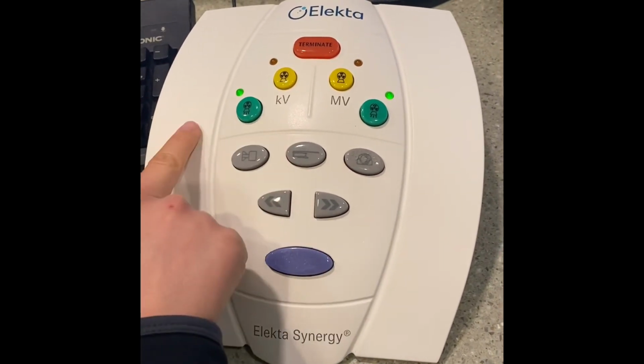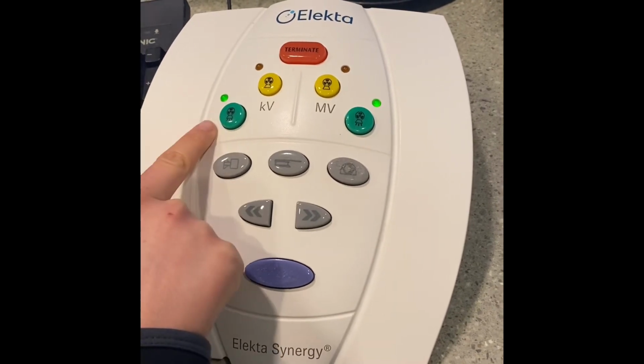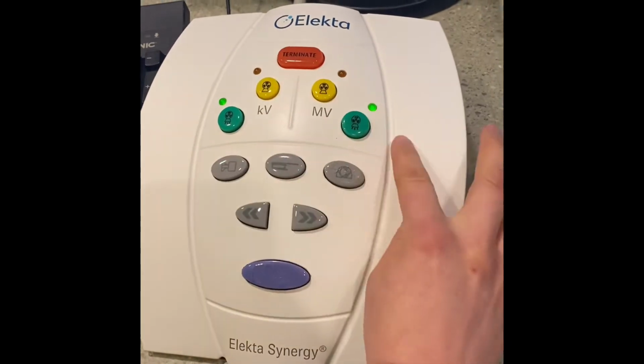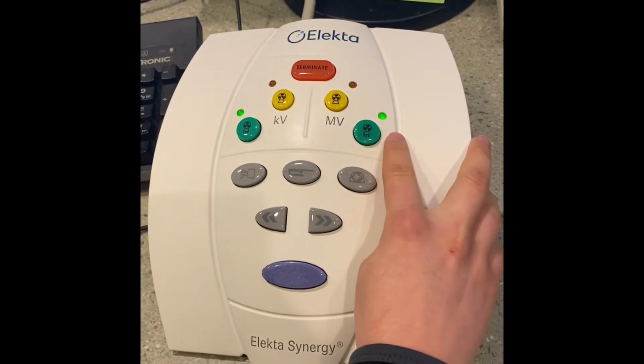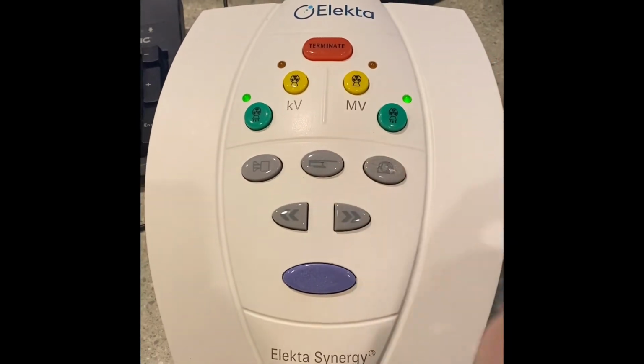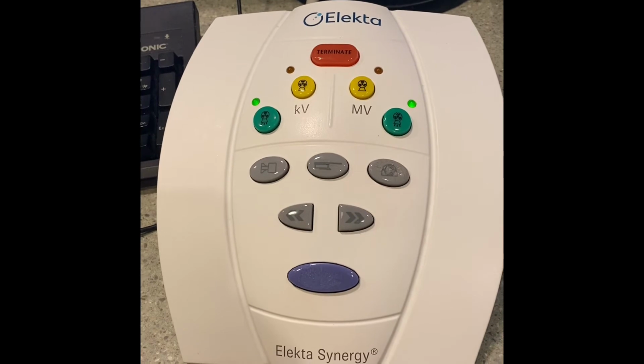So like we talked about in the room for our cone beams, this is the button that would allow us to turn the beam on and start the cone beam. The yellow button would pause it. The green button would start our treatment beams, and the yellow button would pause it. And then the red button, in case of an emergency, would just terminate the beam, and then you would have to go into the room.